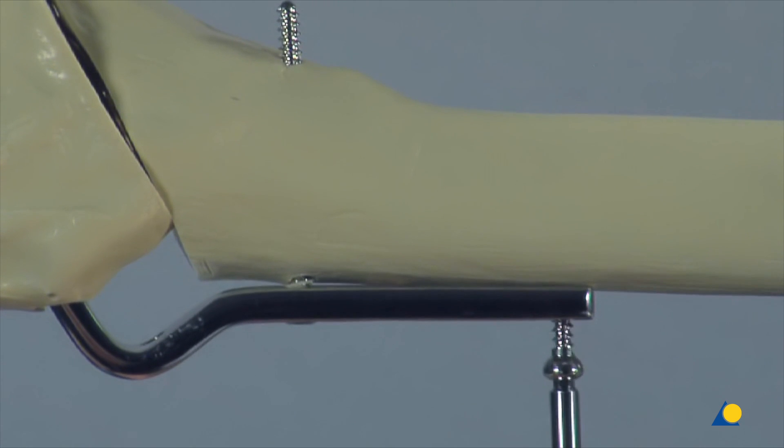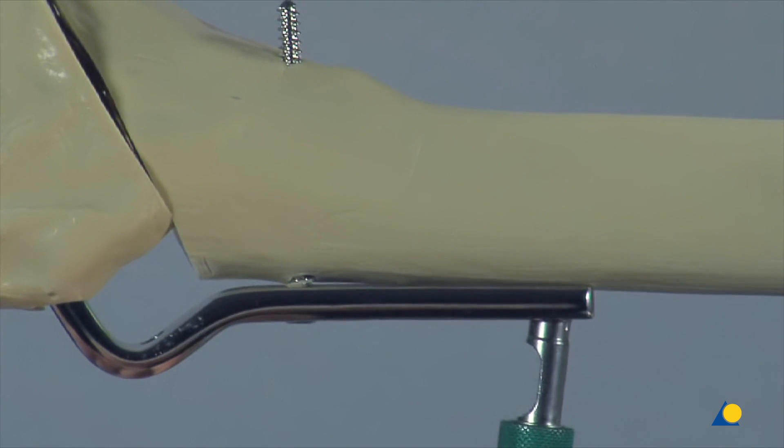The distal monocortical screw is now replaced by a bicortical screw in the neutral position.